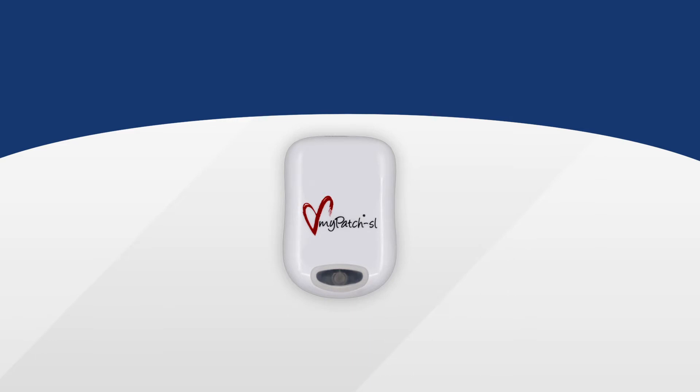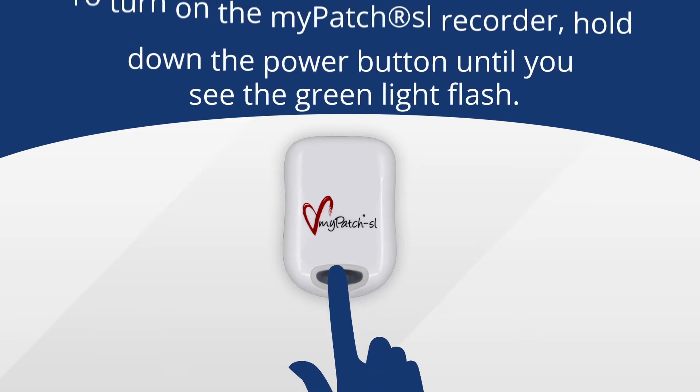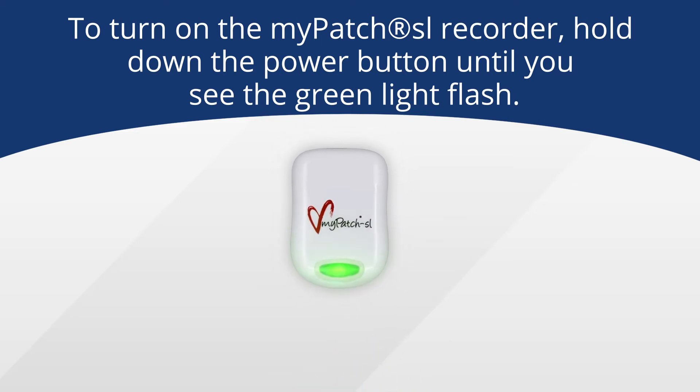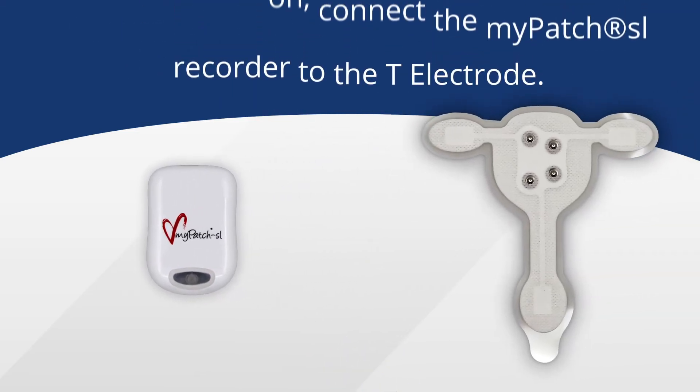Next, you will want to ensure that your MyPatch SL recorder is properly turned on. To turn on, simply press and hold the button at the bottom of the recorder until you see the green light flash.